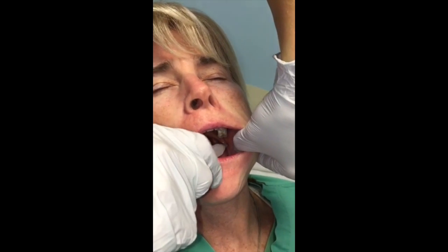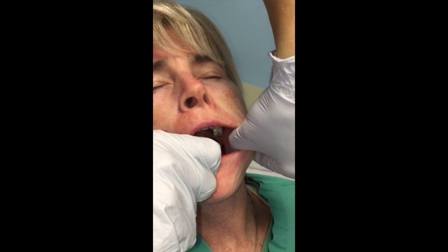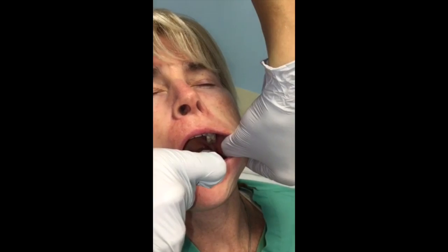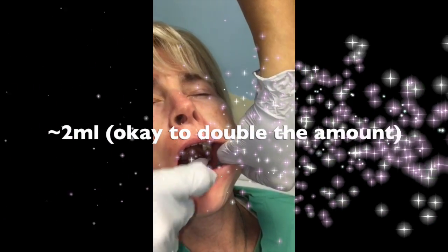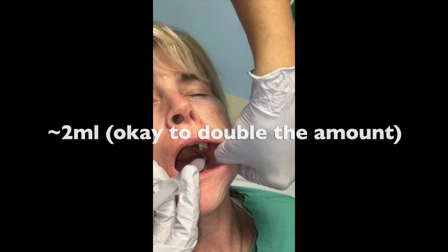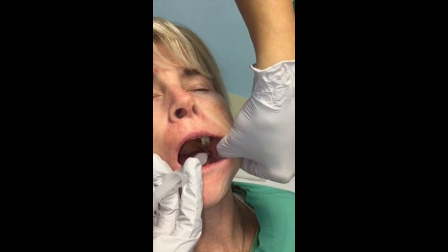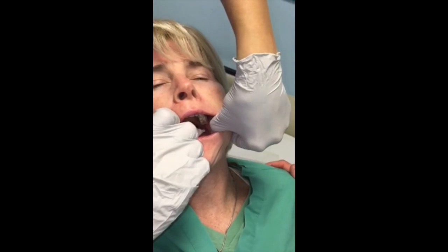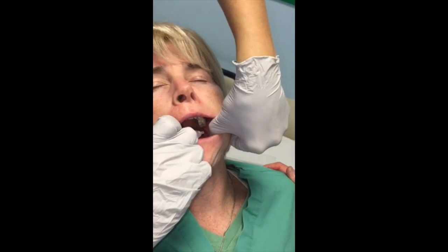Aspirate a little bit. Nothing. Slowly. And how much volume are you putting down? Normally our dental cartridges are 1.8 ml. You want to inject slowly because it does put a lot of pressure back there. I'm going to give you 4 ml — I think that should be fine.